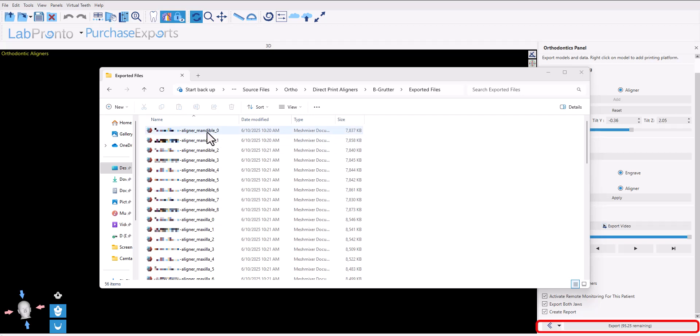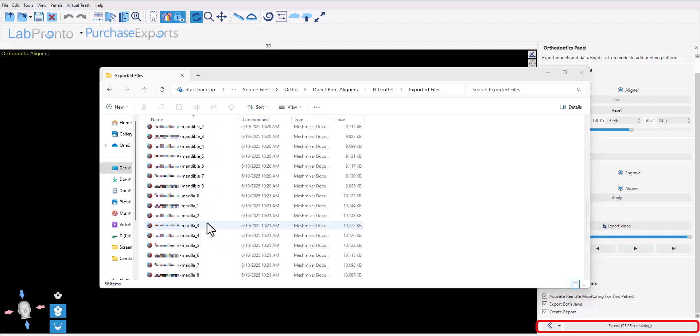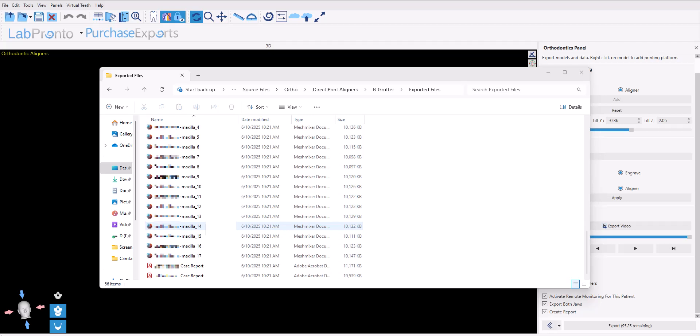The relevant files will be exported to your computer. You can see in the exported files folder you have the aligners for the mandible, the aligners for the maxilla, the models for the mandible, and the models for the maxilla, all exported to the same folder including the case report for the case.